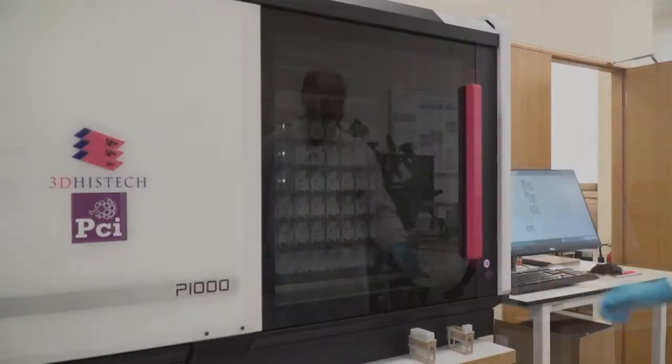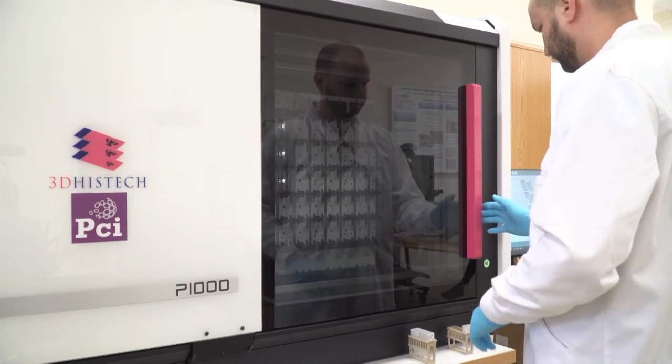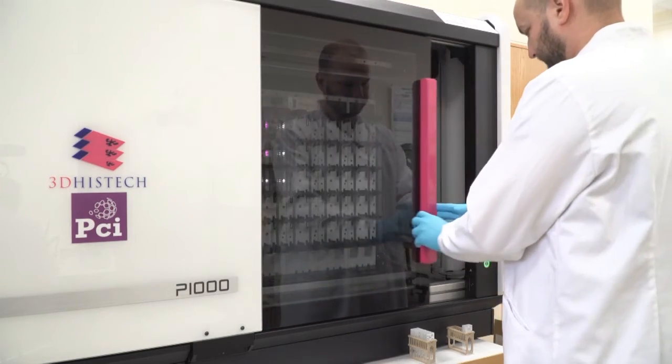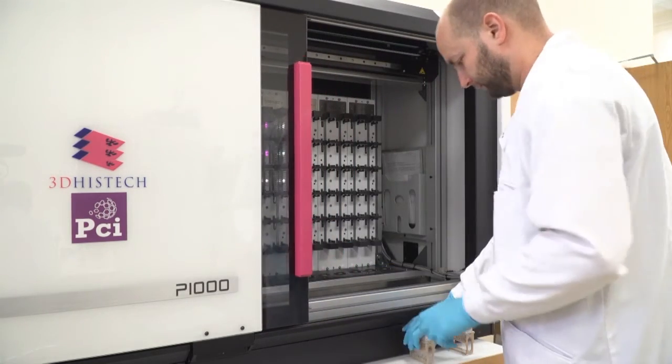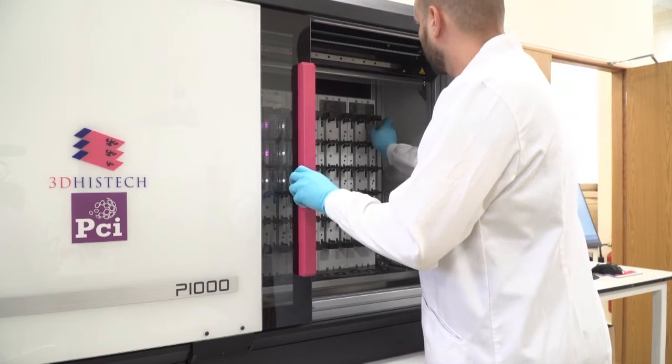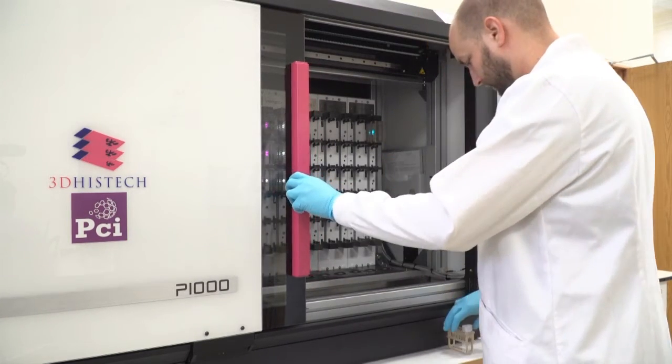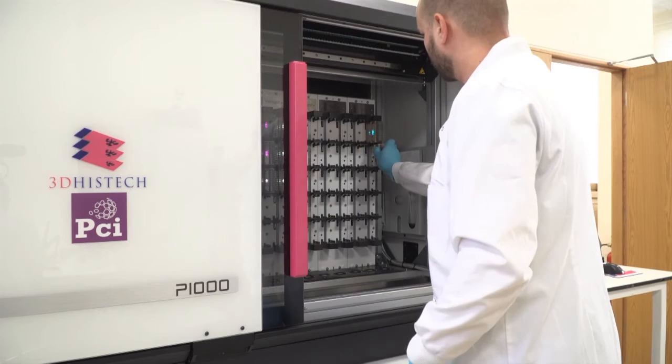To load a slide, we just push this button on the front. When it turns green, we open up the sliding door. The slides go into a Sakura rack, and in this case, they go in very easily.